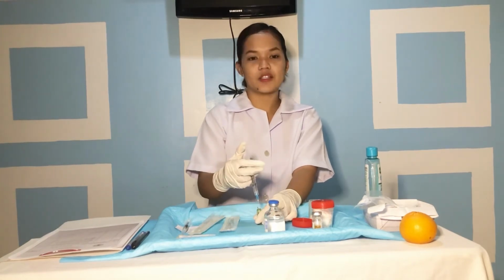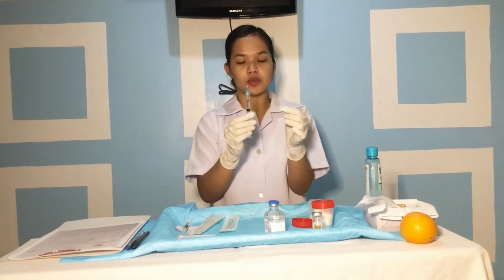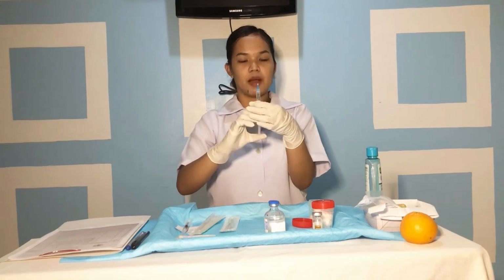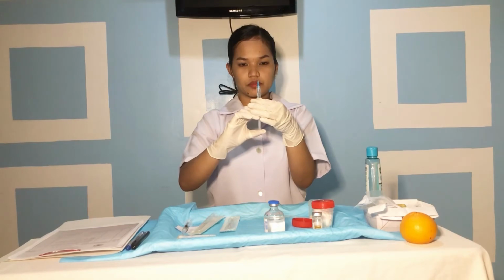To expel excess air bubbles, we remove the needle from the ampule. We hold the syringe with the needle pointing up, like this. We tap the side of the syringe to cause the bubbles to rise toward the needle. We draw back slightly on the plunger and push the plunger upward to eject air, but do not eject fluid. Withdrawing the plunger too far removes it from the barrel. Holding the syringe vertically allows fluid to settle in the bottom of the barrel.